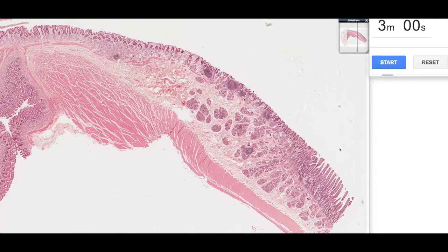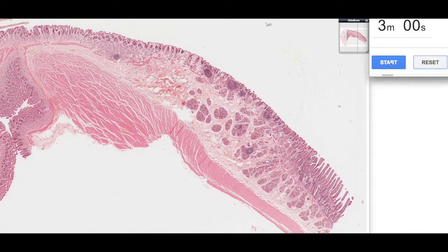Hi and welcome to another episode of 3 Minute Histology with Jamie Chapman. Today we're going to be looking at the junction between the pyloric stomach and the duodenum.